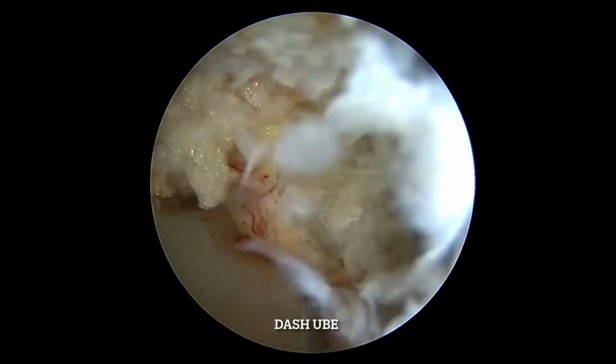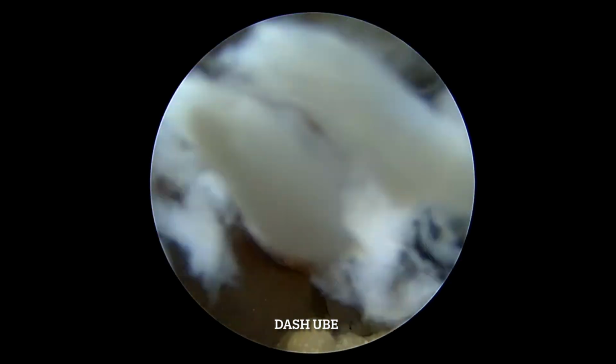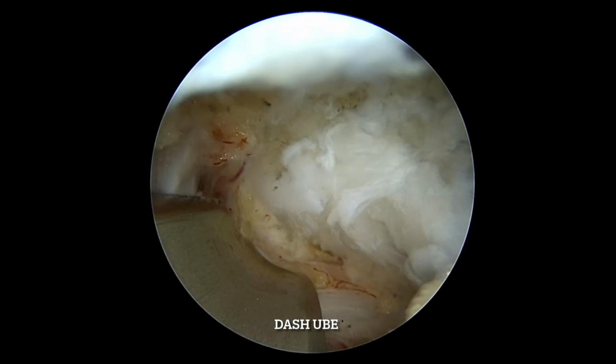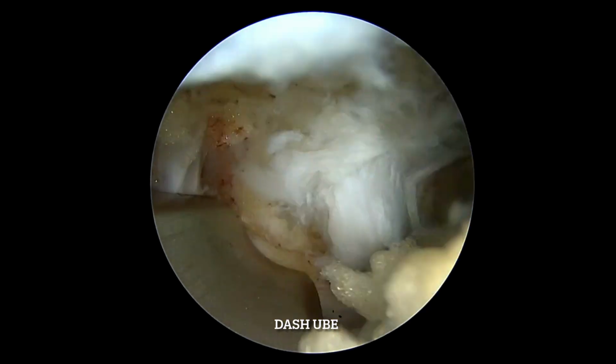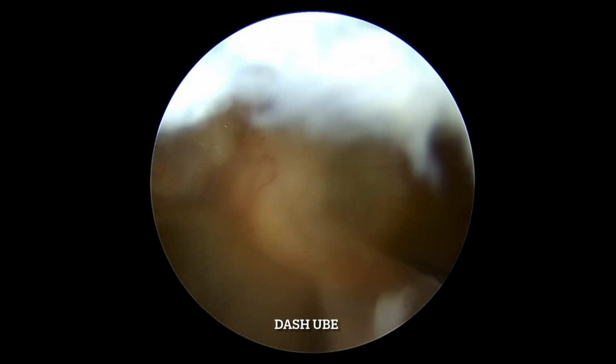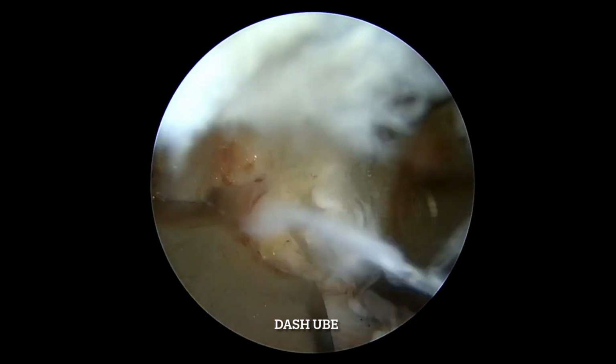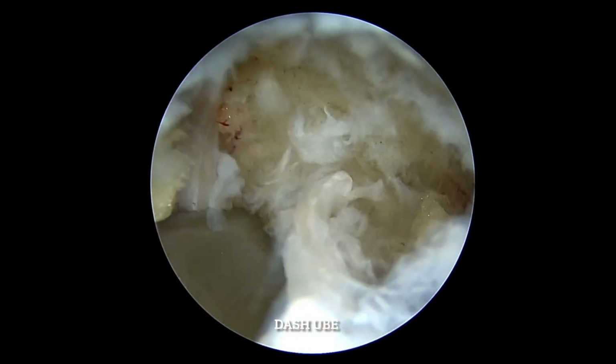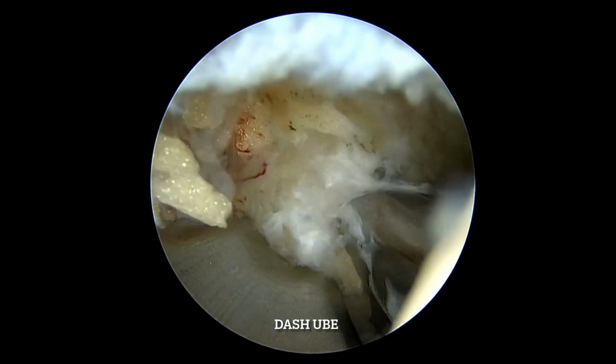This is an outside-in technique, so it provides a very wonderful visualization of this area. You can see many structures. Pathologies like far lateral disc, recurrent disc, annuloplasty, foraminoplasty, all of these can be nicely done with this. Unilateral pathologies especially can be handled by this technique.